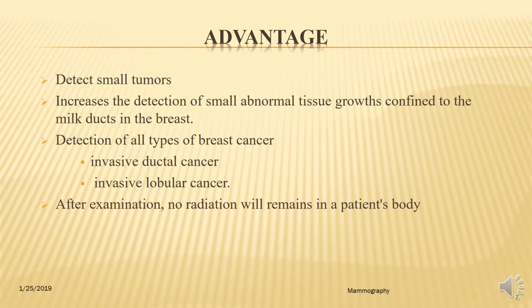No radiation is another advantage. No radiation remains in the patient's body after an X-ray examination. X-rays usually have no side effects in the typical diagnostic range of this exam.